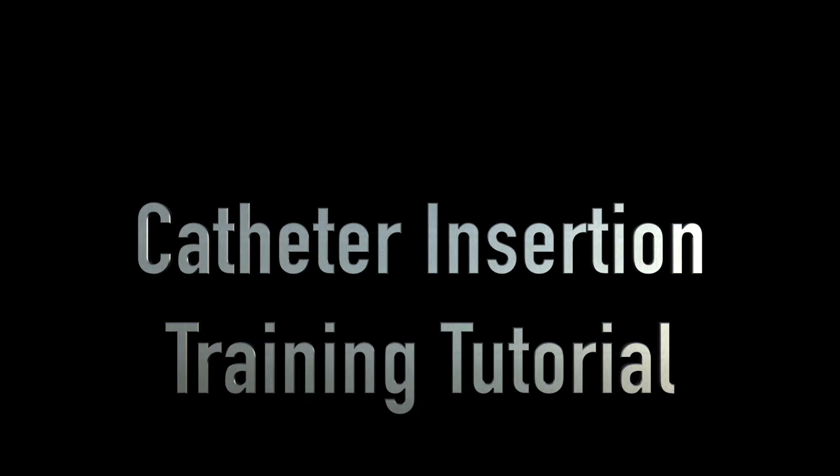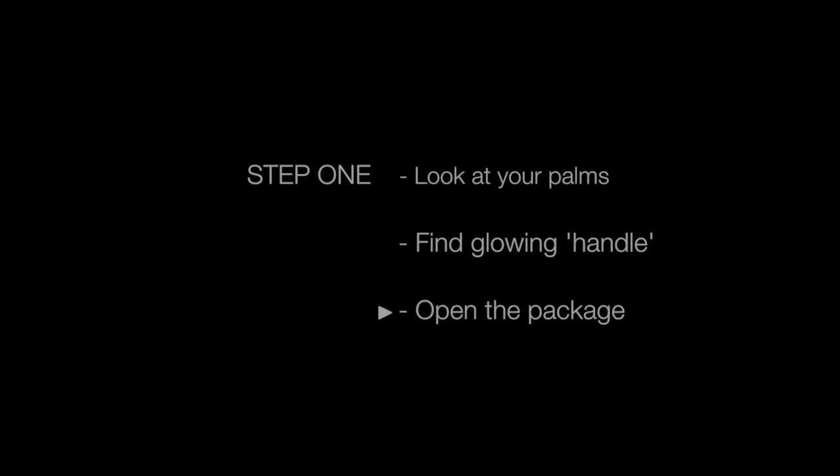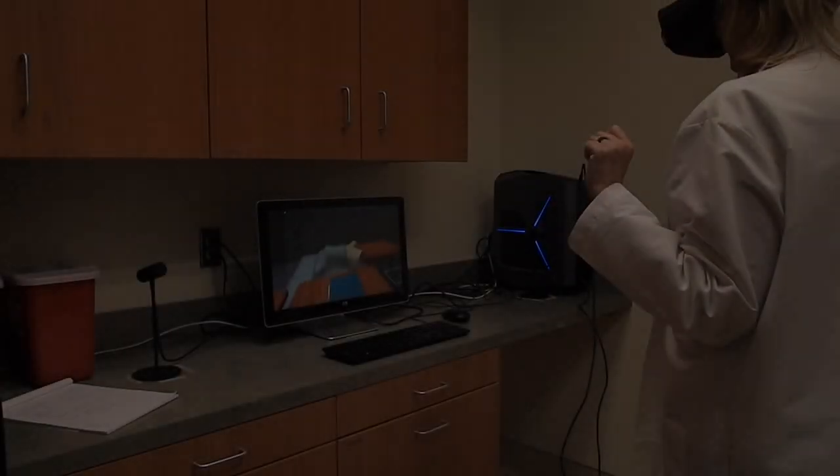Hello and welcome to the catheter insertion virtual reality training video. This video will show you how to use the virtual reality catheter training tool.